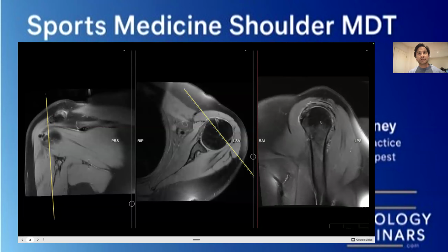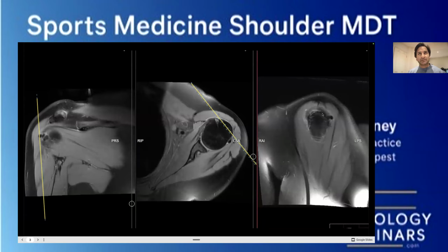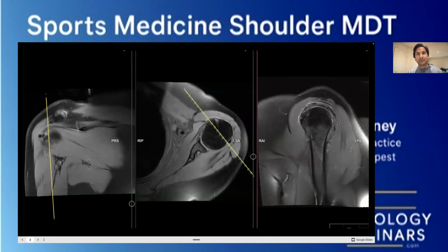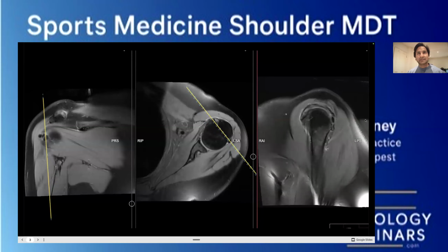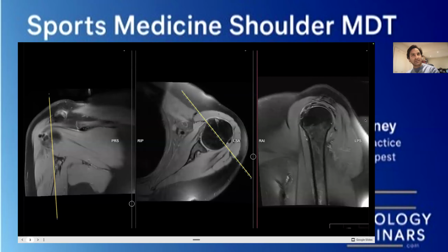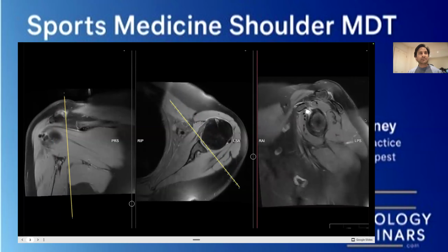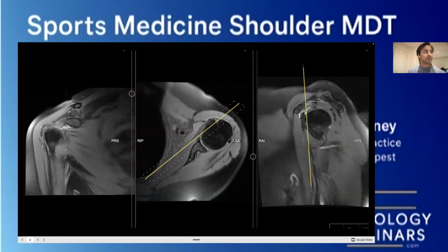But when we scroll through this, we were talking a lot about how things taper into one another. And what you can see here is that you've got this sort of thin tendon going along here, but there is something that's kind of a bit of a blob that pops up there, and maybe another blob that pops up there. And that doesn't seem right because they kind of come in and go, and they don't seem to go into any tendon, any muscle, or any bones. And we think, okay, where did that come from? Let's go back to the previous views and see if we can find them anywhere else.